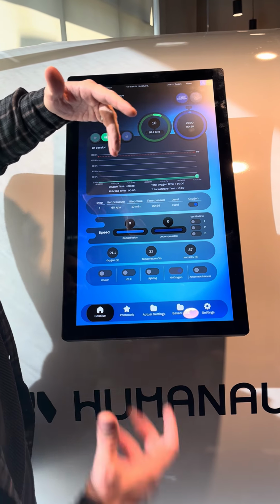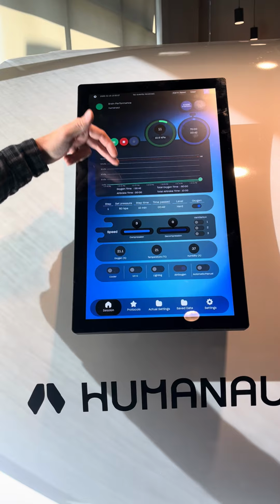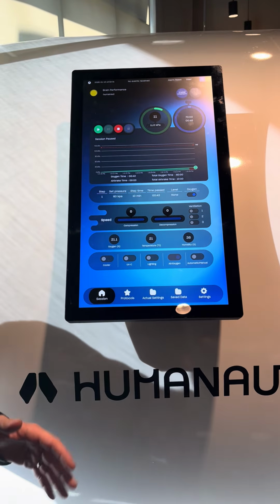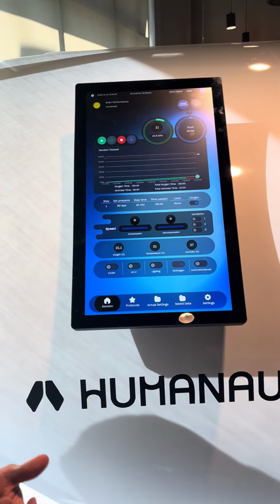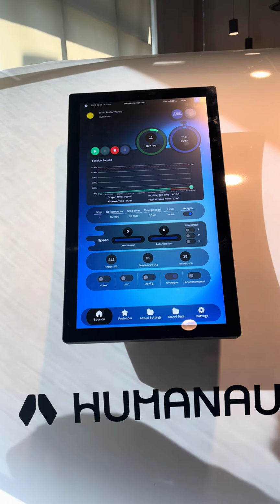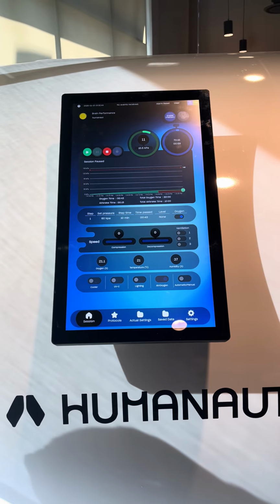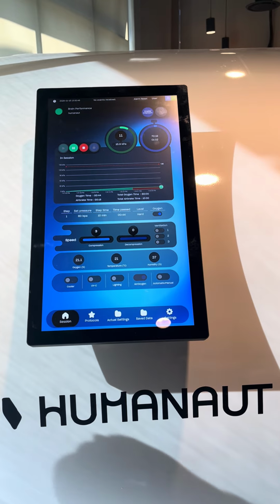Or speak out loud if you have the walkie-talkies, you have the intercom and it's working well. So we've surpassed 10 kPa per minute. I'm gonna pause it, especially for the first session. If you know your clients well, you know they're gonna clear their ears. Then that's kind of on the technician at that point. So 10 kPa, we're at a minute, continue compression.